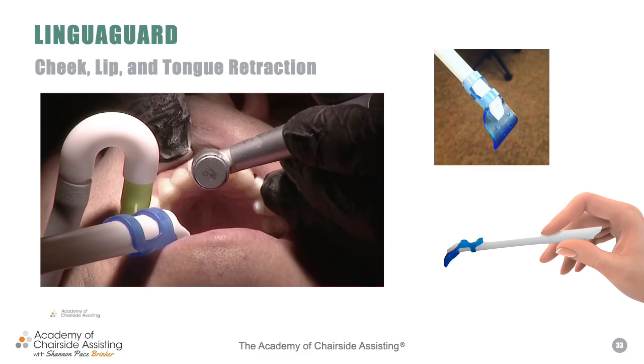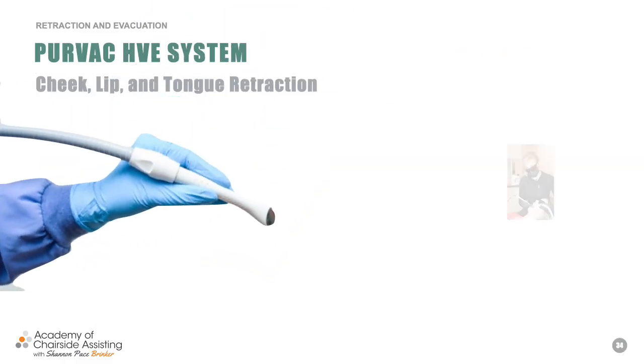So sometimes, depending on the dentist, Dr. Milner likes to use a relief, he likes to use the lingual guard, and he likes to use a cotton roll, okay? He wants everything nice and isolated. All dentists are different, okay? You've got to ask them what they like to use when you start, so this way you can familiarize yourself.